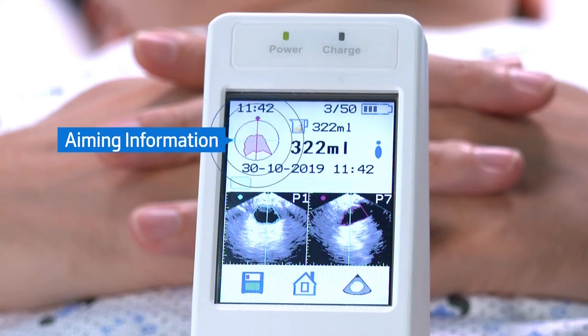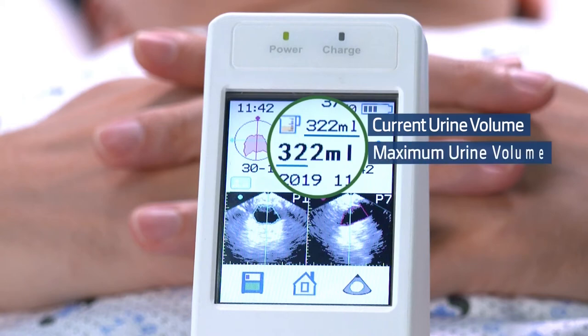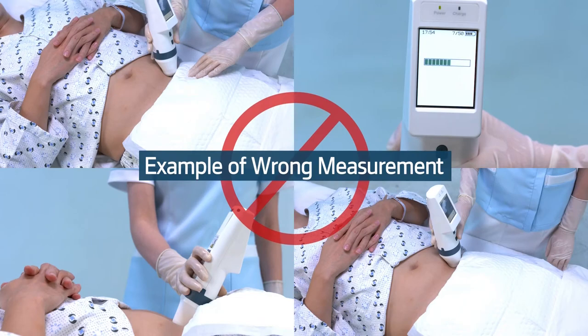Both the current and max scan volume are displayed on the scan result. The following are examples of wrong measurement — the result cannot be guaranteed in these cases.